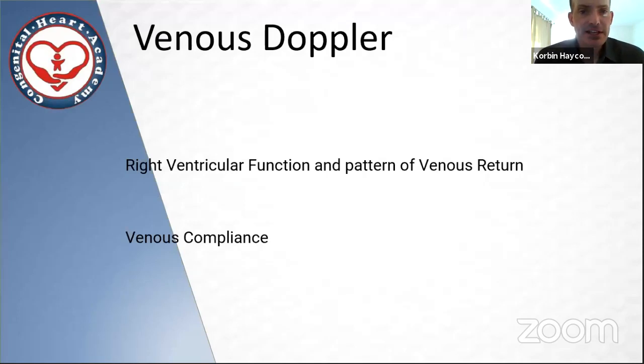The velocities tell us things about flow and pressure, and also the pattern of the velocities and how they change over time can give us information about two things.